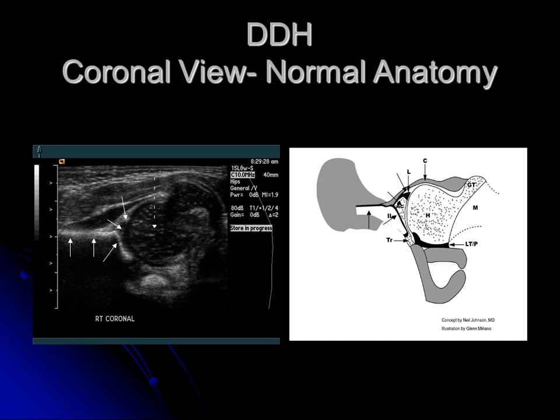This is the labrum, and then this is the cartilaginous femoral head — it looks like cartilage anywhere else: dark with little speckles in it. And then this is the cartilaginous greater trochanter. In infants, the greater trochanter is attached to the cartilaginous femoral head, and then as they grow, they separate out into adult anatomy.